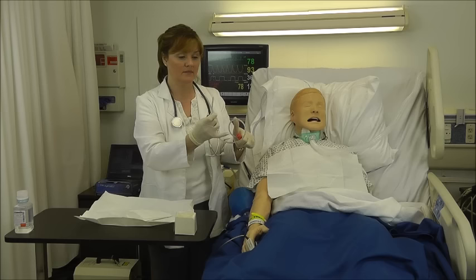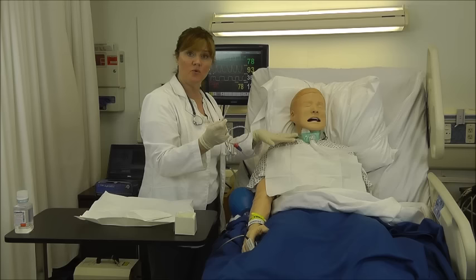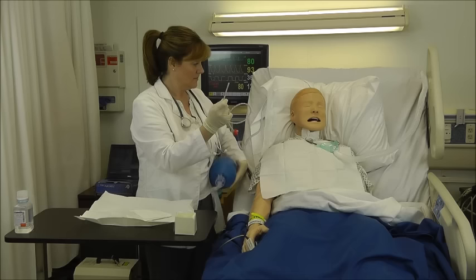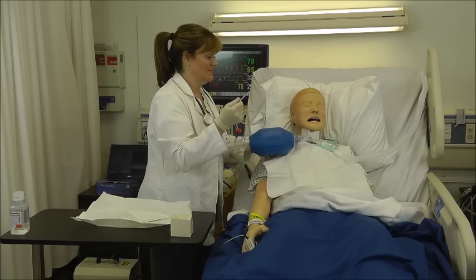I see that he has stopped coughing, he's settling down. I check his respiratory rate, I check his pulse oximetry reading, and if I need to, I can give him more oxygen at this time. I can see that his pulse ox has dropped to 93, so I'll give him a few breaths, only using my left hand, which is no longer sterile, it's just clean. 3 to 6 breaths. His rate of breathing. And now we're ready to go for a second pass.